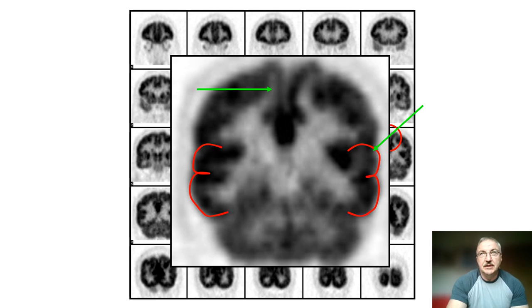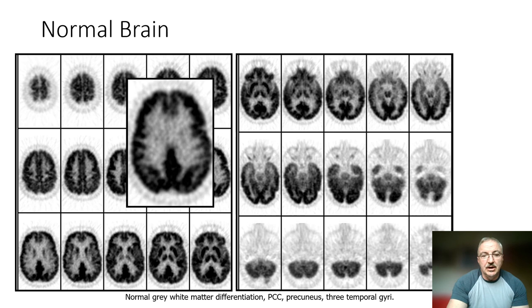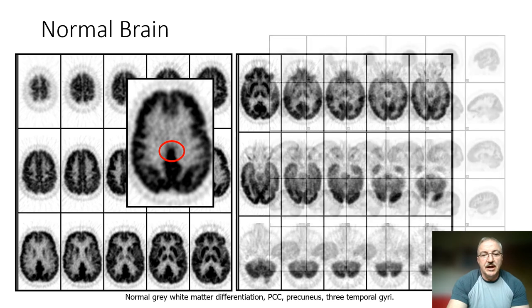We would say that this pattern is not suggestive of the presence of an intrinsic neurodegenerative dementia. Looking again at the normal brain, we note this homogeneous pattern, the relative maintenance of the grey-white matter differentiation, and no comparative loss of activity. Here is the posterior cingulate gyrus.